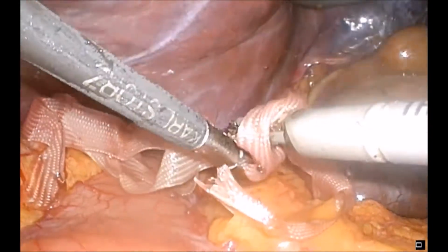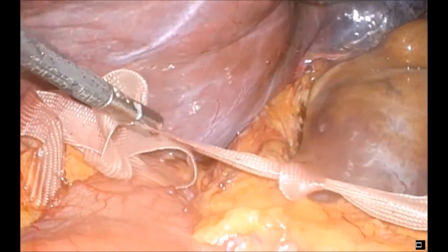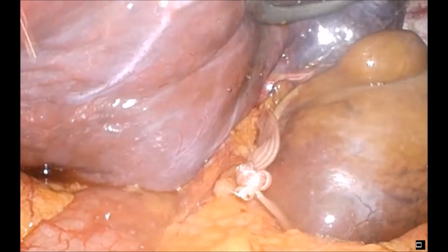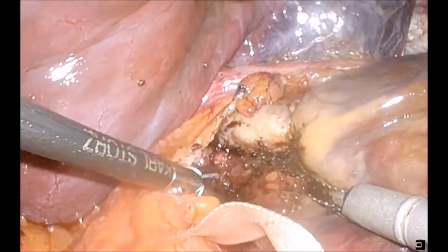I elected not to rush to divide the bridge of tissue here, as one would expect some ooze and bleeding from that, and we'll come to divide it later on rather than early on in the operation.